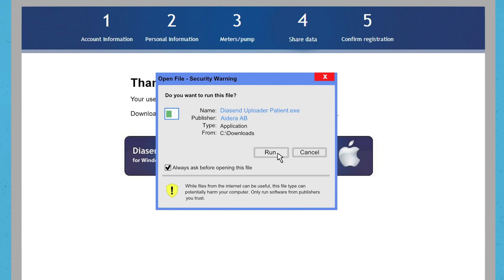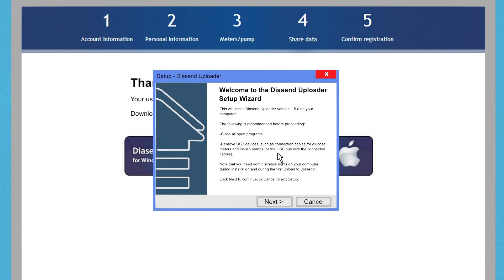This is an example of what the popup installation window might look like on your PC. When you click on Run, you will get another popup to start the setup wizard for Diacend Uploader.